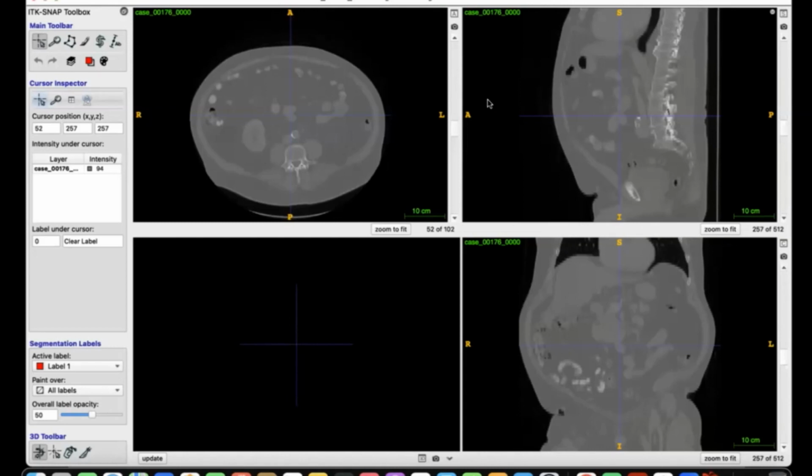So this is a CT image, right? And I also want to ask you one thing here. For taking an image, maybe the patient can lie on their back on the table, or maybe belly down on the table, right? So based on this axial view, what do you think? Is this back on the table or opposite?